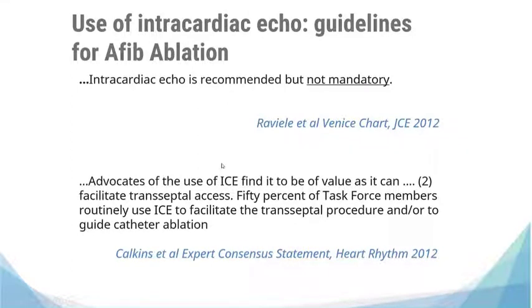So if you look at the consensus document, you see that usually the use of intracardiac echo to support the entire procedure is recommended but not mandatory, and we have to admit that we have conflicting feelings about the routine use of intracardiac echo. We can say that at least in Europe, this is used on a routine basis in no more than 20% of the procedures, according to the EHRA surveys.